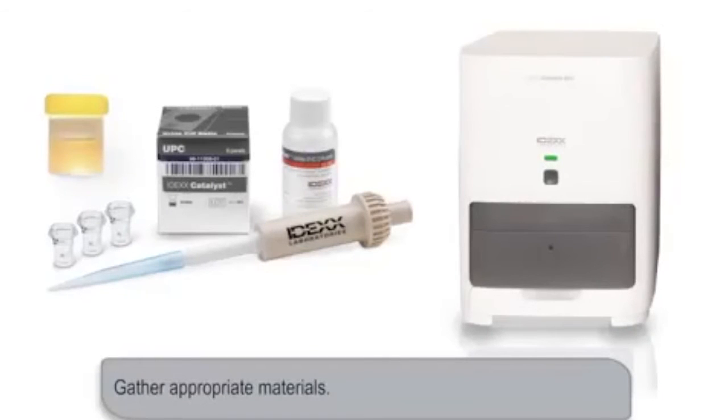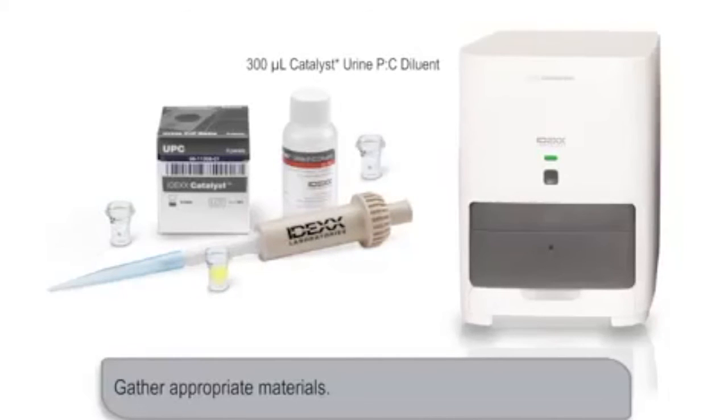To run a UPC test, you'll need 300 microliters of urine in a Catalyst sample cup, 300 microliters of Catalyst urine PC diluent in a Catalyst sample cup, an empty sample cup, and UPC slides which include both a urine protein and a urine creatinine slide.